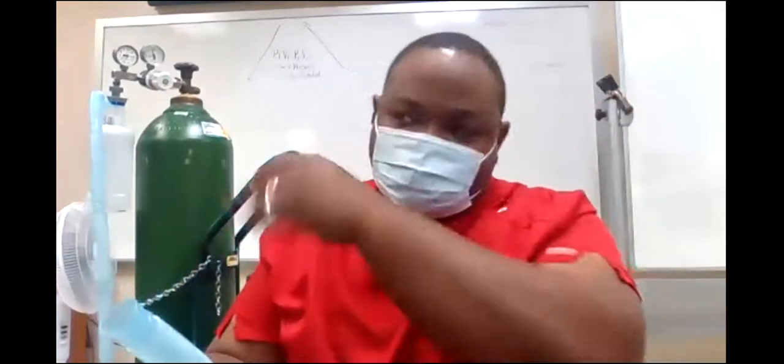You should always see mist coming out of here. Even when I inhale, there should still be a little bit of mist coming out. If I don't see the mist every time I inhale, that's just an indication to crank up the flow, okay? Turn this flow up a little bit, all right? You should always see mist coming out the end of a T-piece, all right? Every time you're on a T-piece, always watch for that flow. You should still see the mist coming out. If you don't see the mist coming out, that means you need to increase the flow.